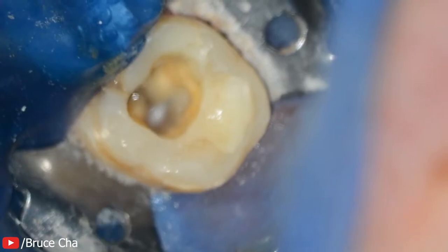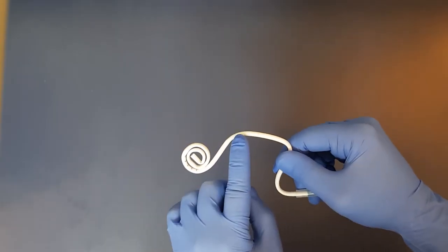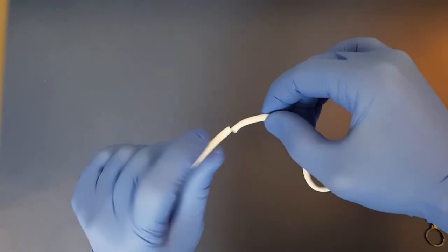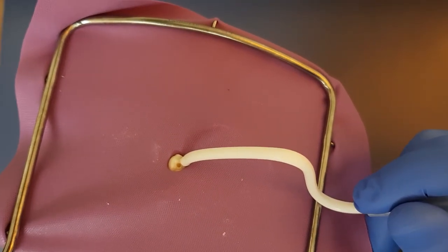So the second tip is to make your own surgical suction. We all know you'll ideally use a small surgical suction tip to aspirate sodium hypochlorite but you might not have these where you work. Instead you can make your own using the curly saliva ejector — use some scissors to cut them, and it might be a little bit fiddly because of the wire inside but you can just twist and turn it and it will separate. You want to get this suction as close to the pulp chamber as possible so you can suction the hypochlorite before it leaves the pulp chamber, so there's less chance of hypochlorite leaking into the patient's mouth through the rubber dam.